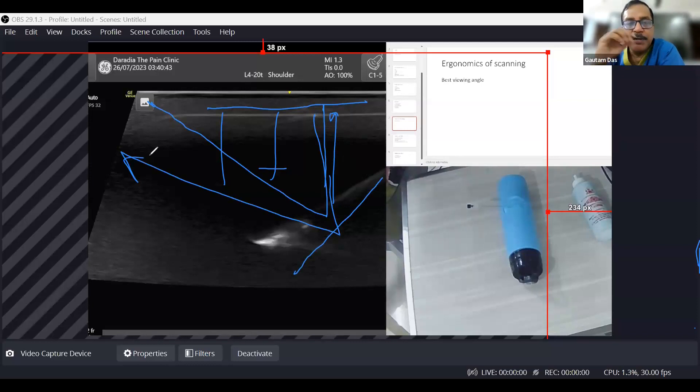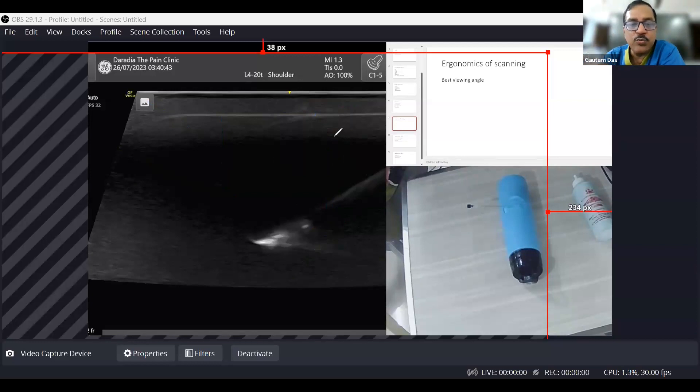Always remember when you are placing a needle, try to make the angle 30 degrees or less. The more horizontal your needle is, the more bright it will be. So how do you achieve an angle of 30 degrees or less?